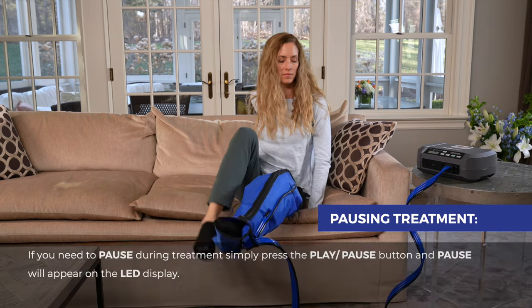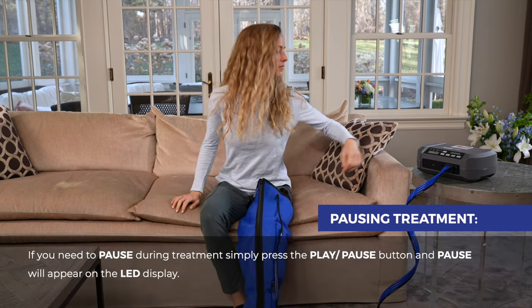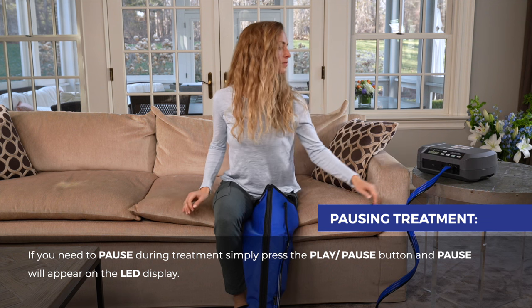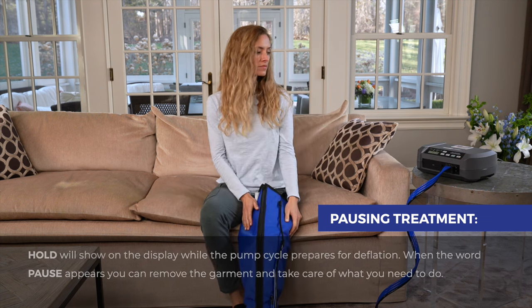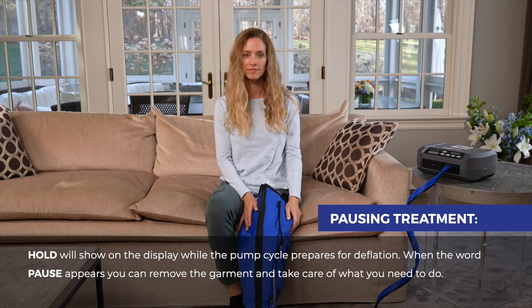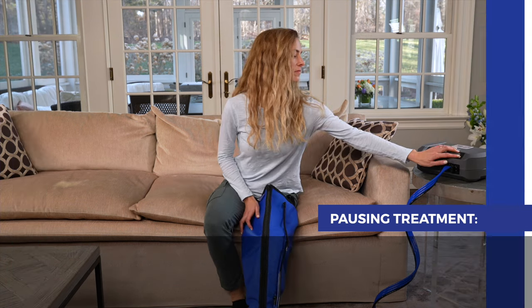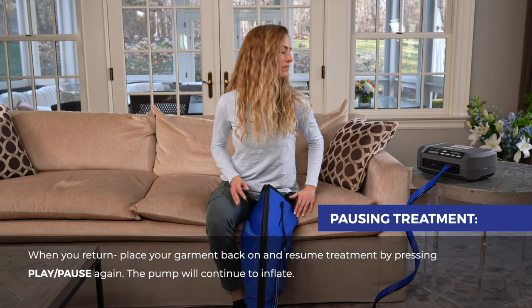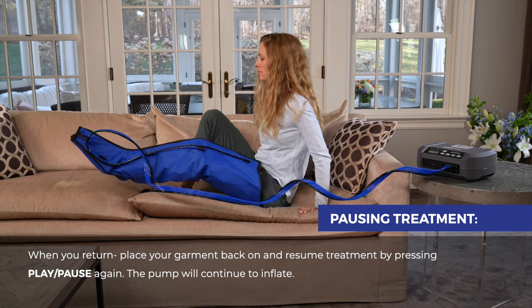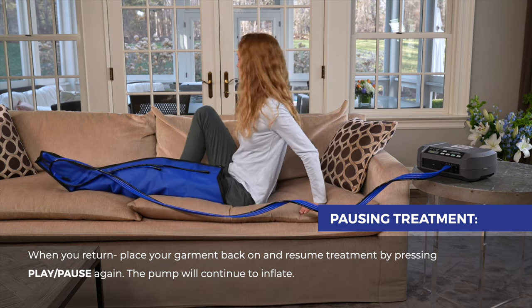If you need to pause during treatment, simply press the play/pause button and pause will appear on the LED display. Hold will show on the display while the pump cycle prepares for deflation. When the word pause appears, you can remove the garment and take care of what you need to do. When you return, place your garment back on and resume treatment by pressing play/pause again. The pump will continue to inflate.